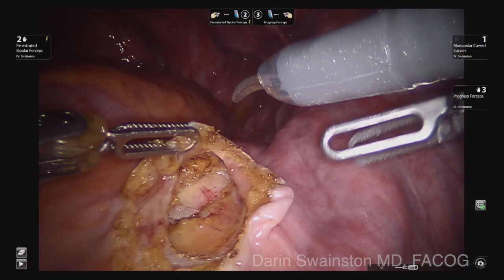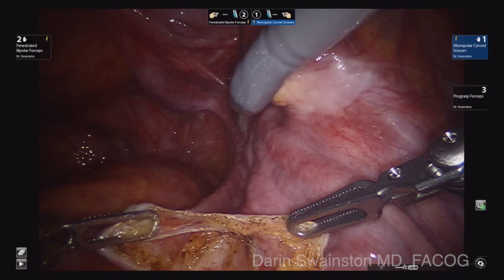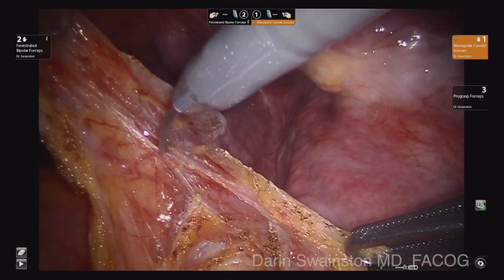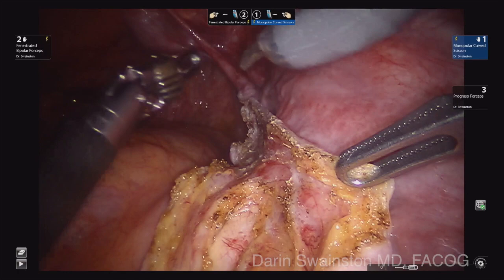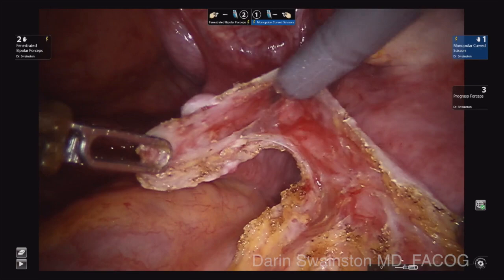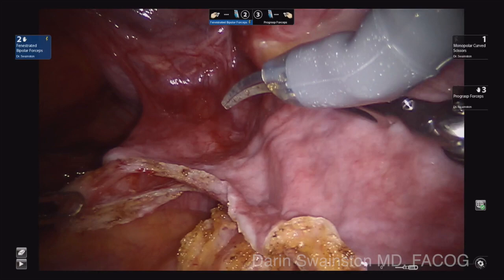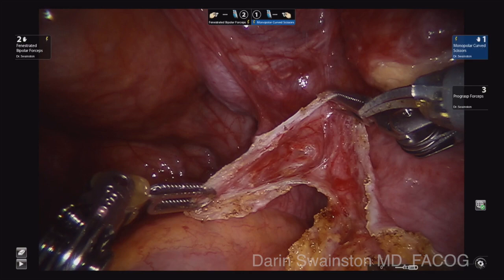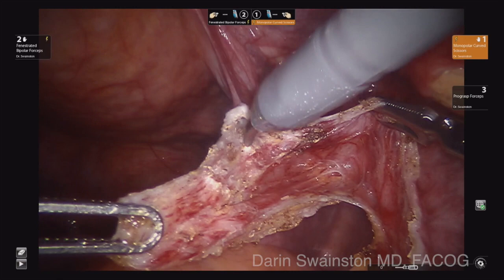At this point I am going to start dissecting down toward the top of the vagina. I am using both instruments to help pull on the edges of the peritoneum to make that dissection. I have sped this up. You can see where the ureter is off to the side. There is that little reflection of peritoneum — that is a good place to go. The ureter is well above that; you can see it going down the pelvis. It is super important not to get too close to that ureter with the peritoneal dissection, because when you close it later you do not want to tent it or pull it into your closure where the ureter has any kind of compromise or is kinked.